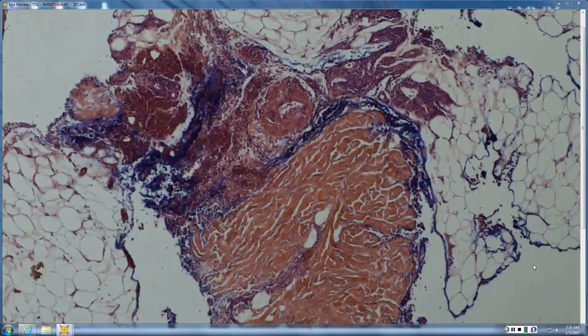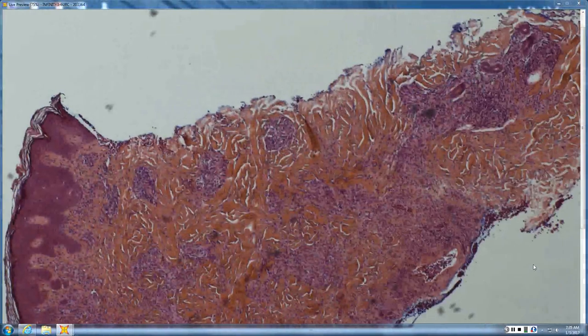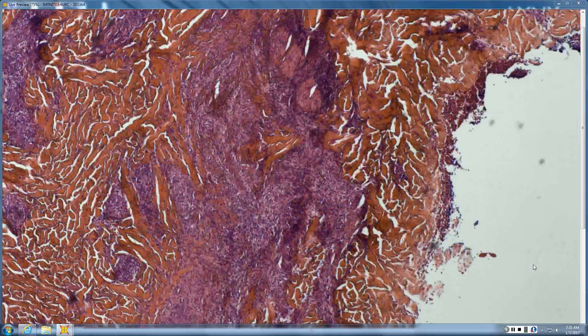One of the things which we're not seeing in this case is we're not really seeing sebaceous gland. What if I told you that there was distinct necrosis of the sebaceous gland? So suppurative folliculitis with distinct necrosis of sebaceous gland. I don't know what that means. Anyone, any thoughts? That's herpetic folliculitis. Herpes. So herpes, you get a suppurative folliculitis.